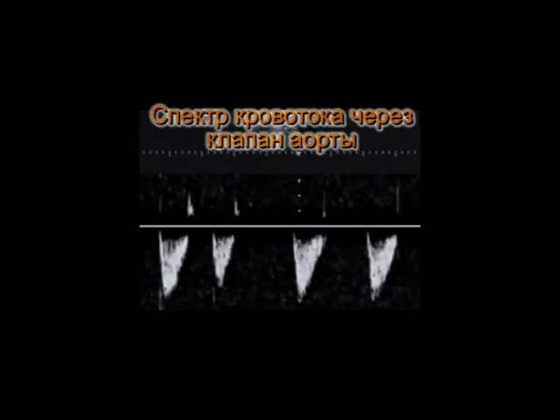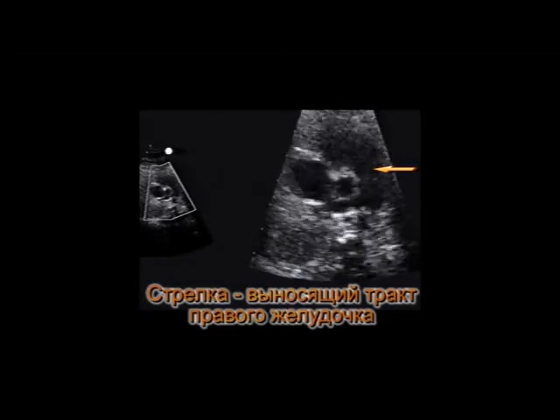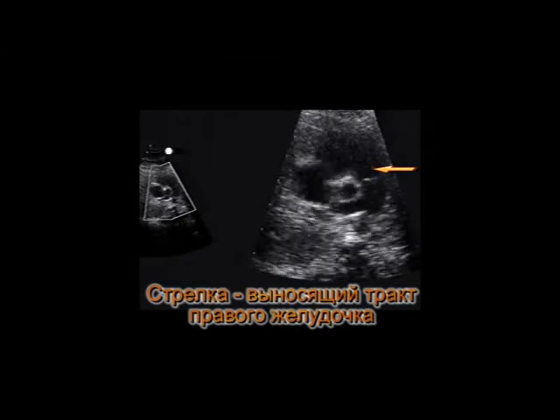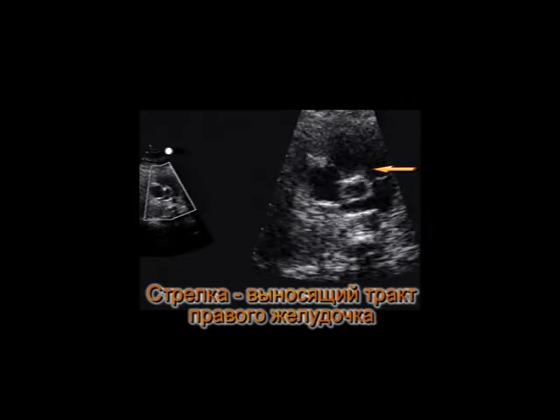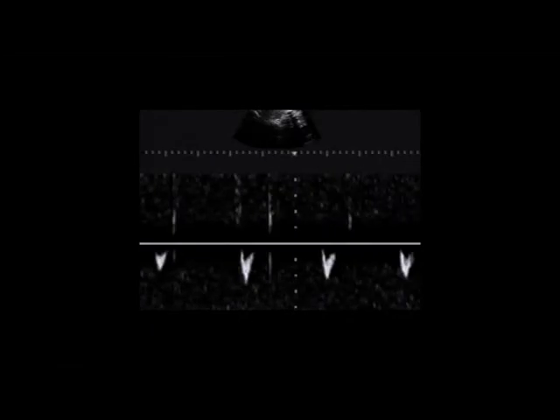В выносящем тракте левого желудочка был зарегистрирован нормальный спектр кровотока. В выносящем тракте правого желудочка был зарегистрирован низкоамплитудный кровоток со значительным снижением интеграла линейной скорости, что говорит о снижении сократительной функции правого желудочка.